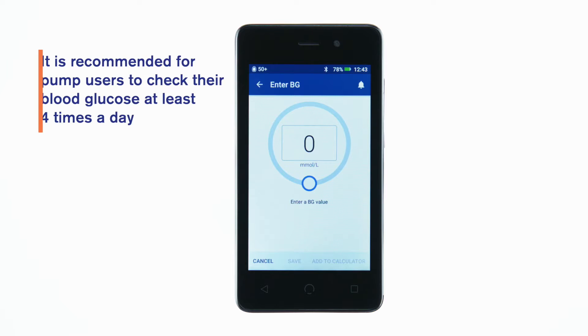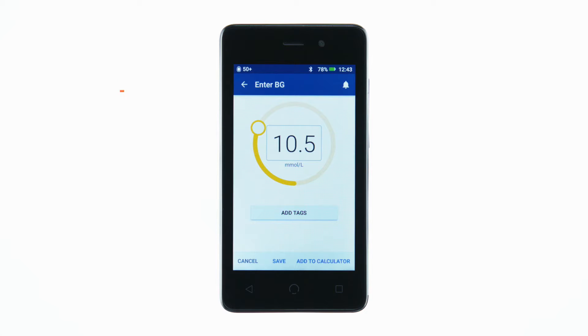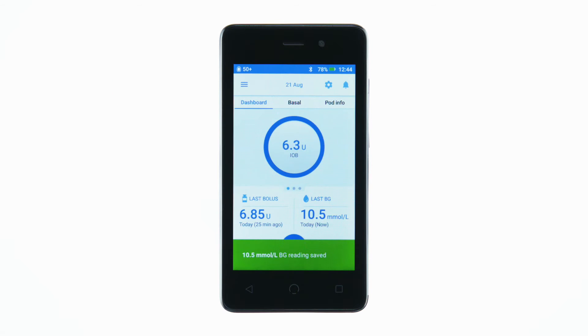After checking your blood glucose value on your selected meter, you can enter it while programming a bolus, or you may choose to enter it to store in the PDM's history.